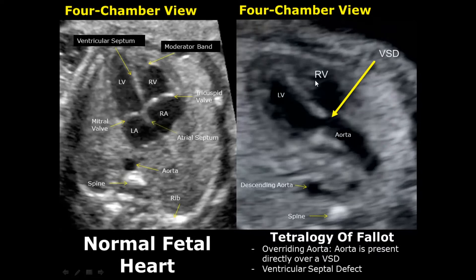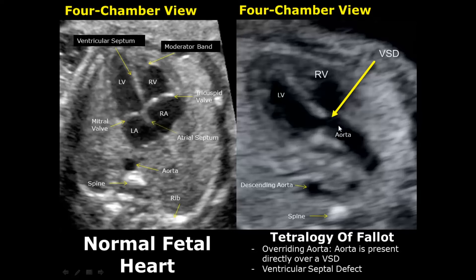Tetralogy of Fallot contains four abnormalities: right ventricular outflow tract obstruction, a ventricular septal defect, right ventricular hypertrophy, and an overriding aorta. Two abnormalities are more easily seen on ultrasound: the ventricular septal defect, and the overriding aorta, in which the aorta overlies the ventricular septal defect.